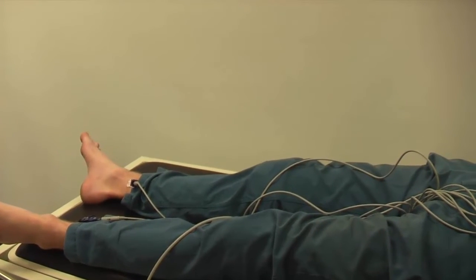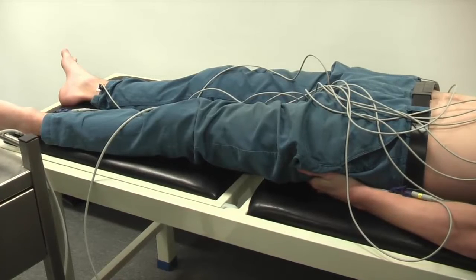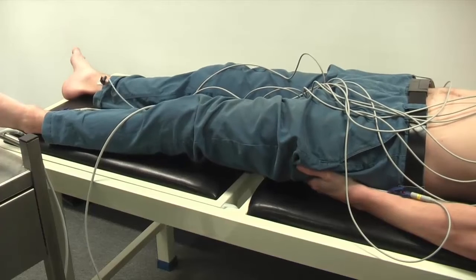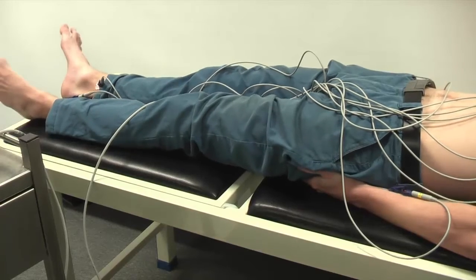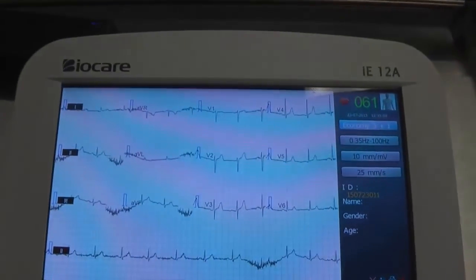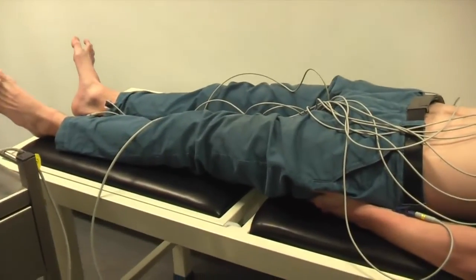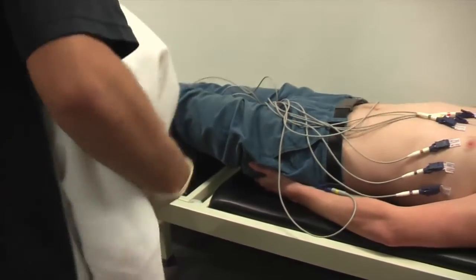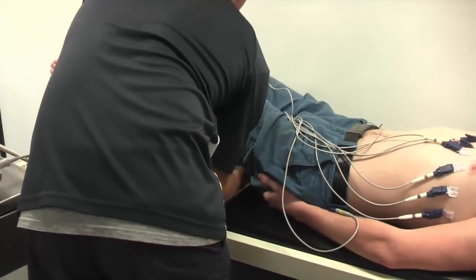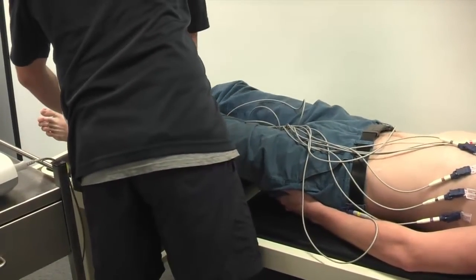Another example: if a patient is tall, they may be hanging off the bed and have their legs in an unnatural straight position, where it's more comfortable for them to have a slight bend in the knees. You can see that gives you baseline wander and a lot of muscle tremor. A good way to alleviate that is to place a low pillow underneath the patient's knees to give a more natural body shape, so the patient is not going to feel inclined to straighten out their legs.